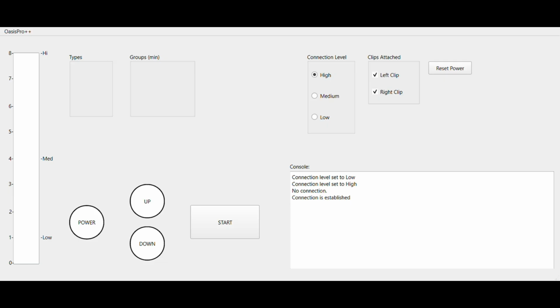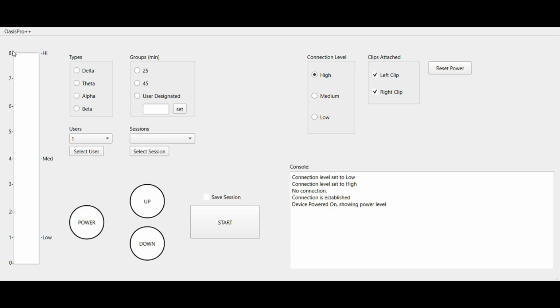So what I'll go through is just the main use case here. So you start by powering on the device. It will display the battery level. Battery's full. You select a user. So I'll just select user one. I'll select alpha waves and I'll select a 45-minute session. For the simulation, it's not in minutes, it's just seconds, so you don't have to wait a long time to see what goes on. And then I'll hit start.